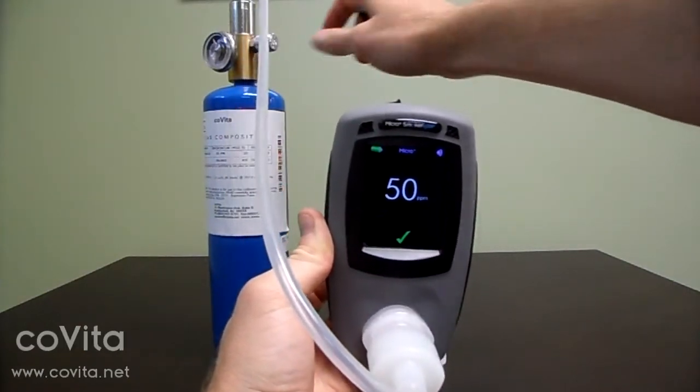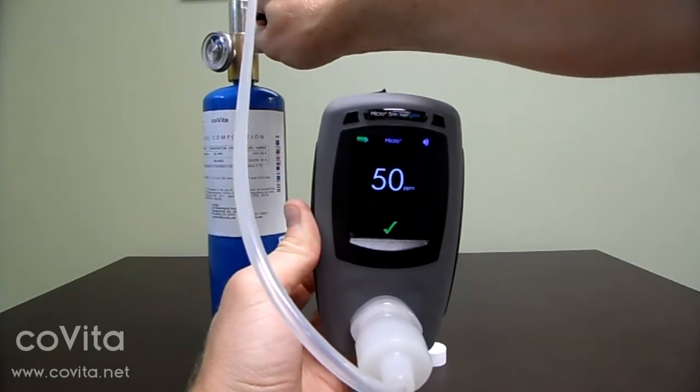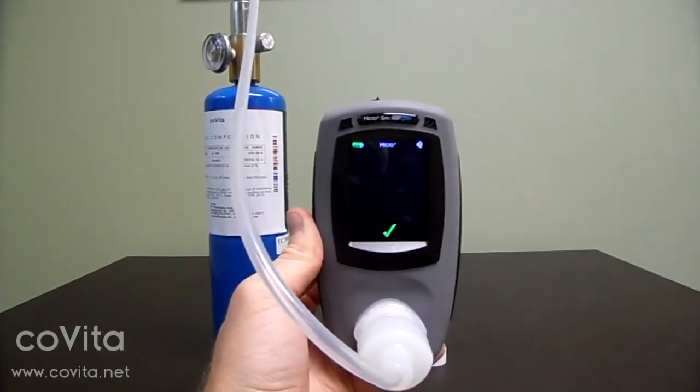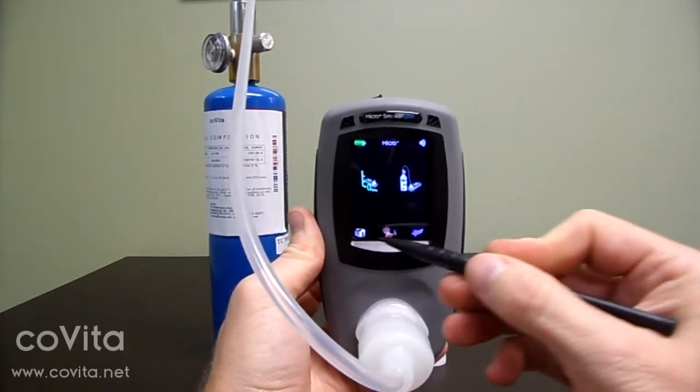Turn off your gas. Touch the check mark icon to accept the calibration. Touch the home icon to return to the main screen.